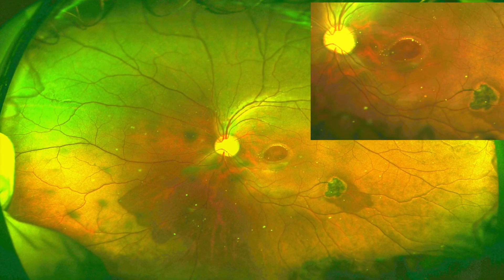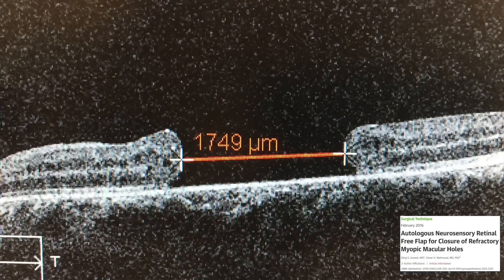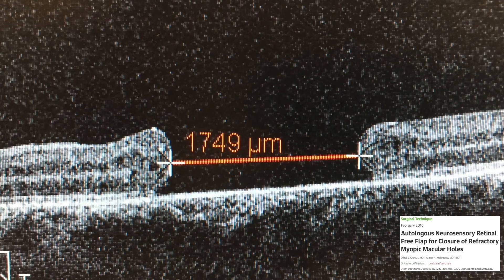In this case, the surgeon performed the autologous neurosensory retinal free flap technique, which involves harvesting a retinal free flap and positioning it over the macular hole to provide a scaffold and plug for hole closure.